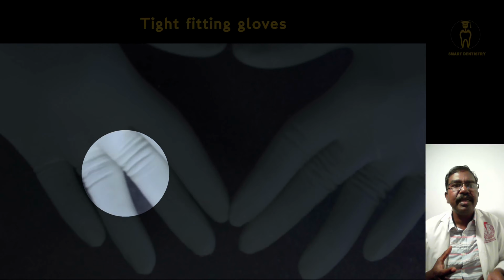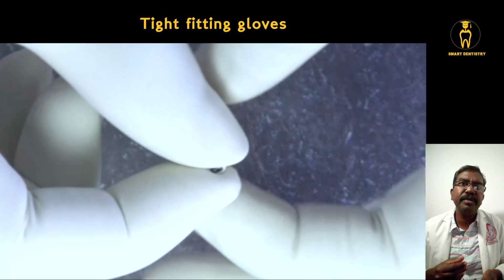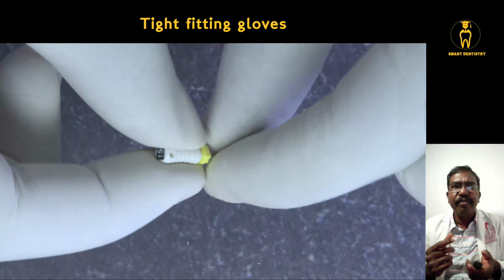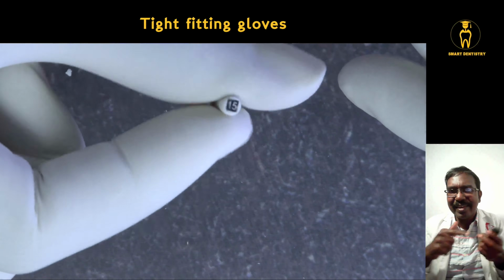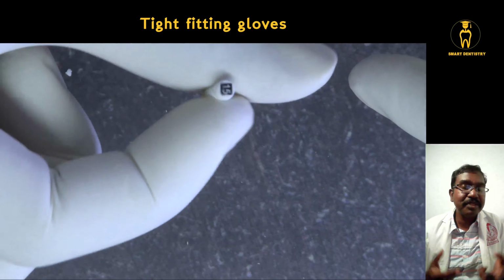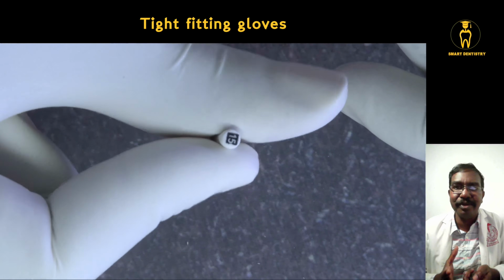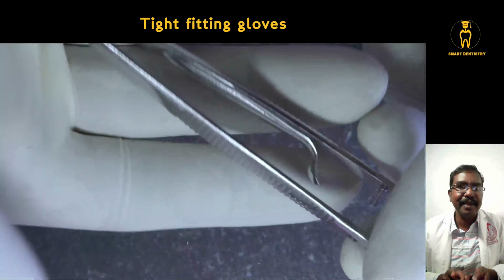It will be perfectly fitting in your hands, so that even when you are doing some watch winding with the file, the file can be easily rotated or twisted without the glove getting entangled or the file getting entangled within the gloves. All these problems can be avoided. Similarly with the locking tweezer or with any other purpose, it will always be easy, and it will be like a breeze that you walk in your patient. So for all endodontic practice, always wear a glove which is tightly fitting.